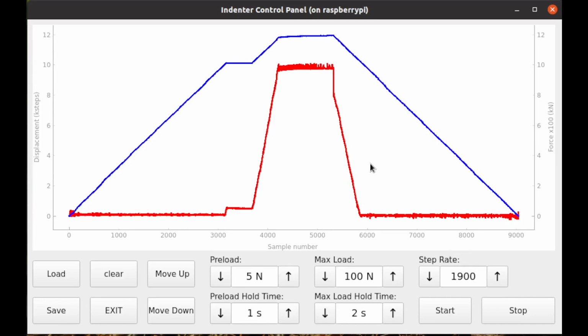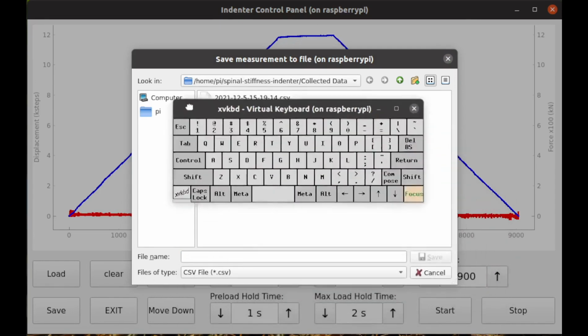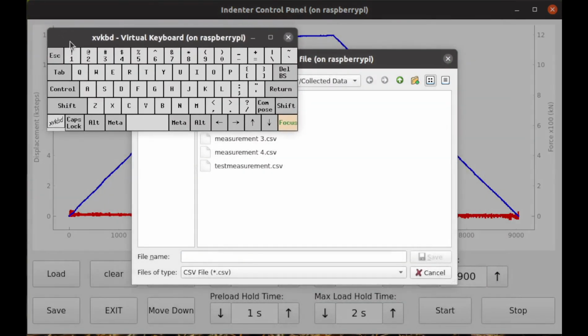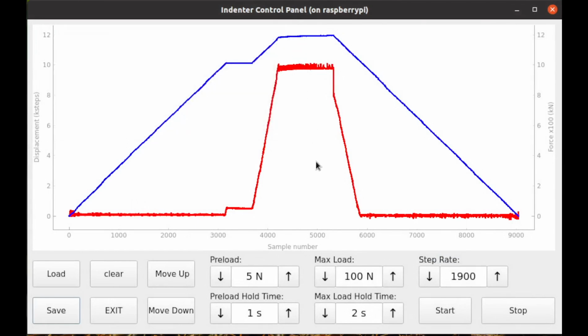Now that we have taken the measurement, it's time to save our data. To do that, we just press the save button and it opens up a save file window as well as an on-screen keyboard that can be used when you are on the Raspberry Pi. To save our data, we just name the file and press the save button. This saves our data onto the memory card.